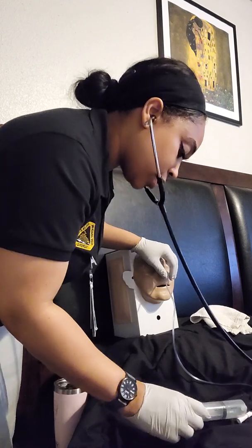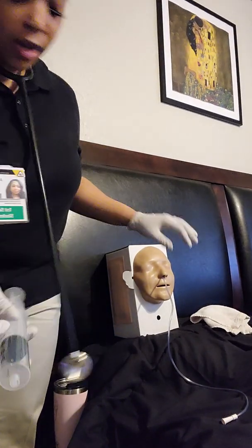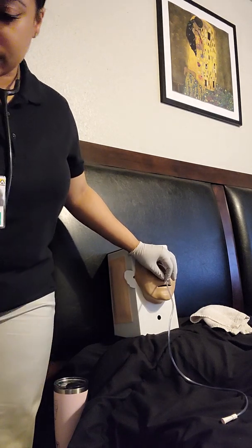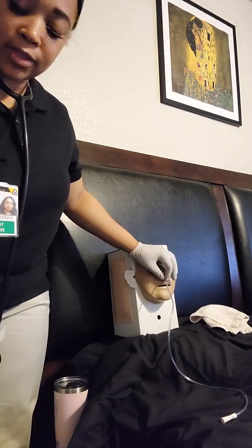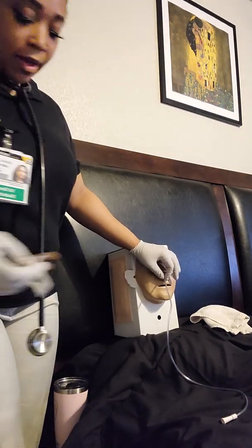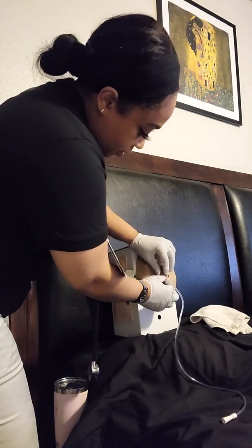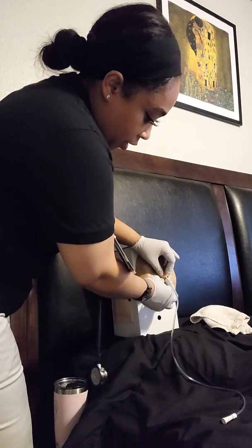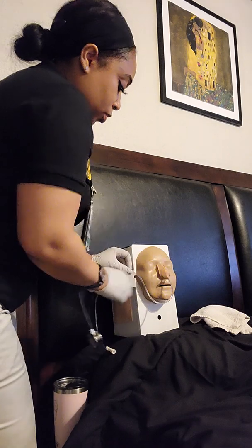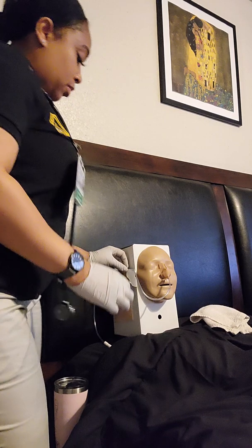All right, and note the color of your gastric juice is green, which is to be expected. And I'm going to go ahead and check that on the pH strip. All right, pH is less than 5. Looks like we're in the right spot. I'm going to apply my butterfly bandage to your nose to hold it in place. Great, and you said you had no allergies to tape, so I'm going to tape this to the side of your face. And make sure you have enough leeway so that way you can still turn your head and have full range of motion. Perfect.